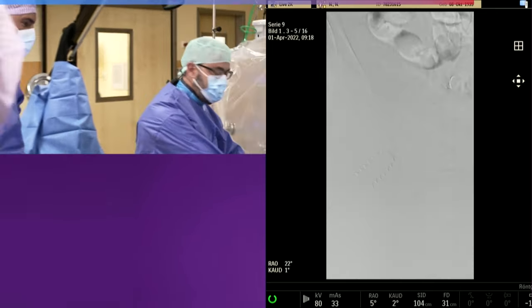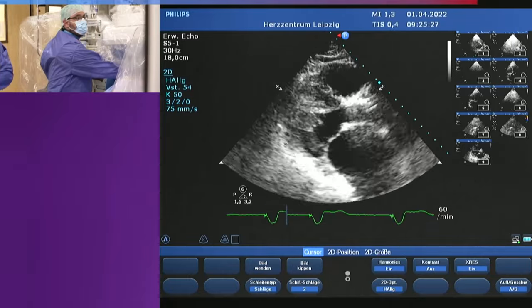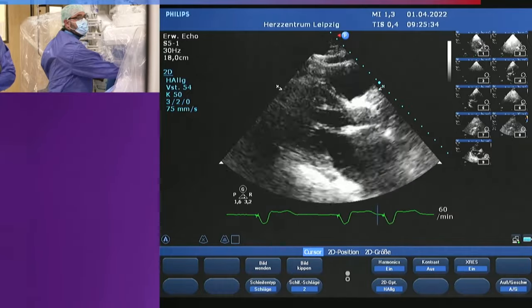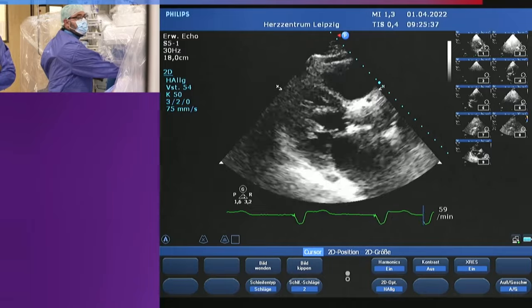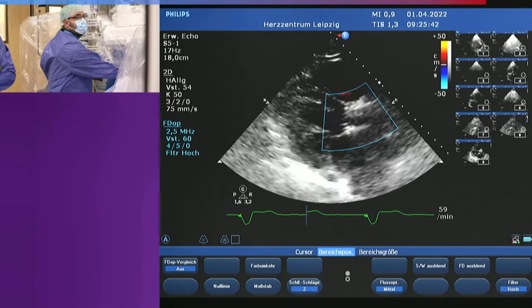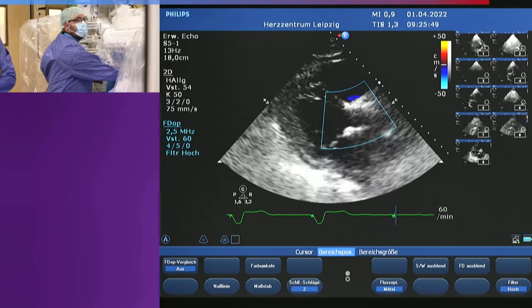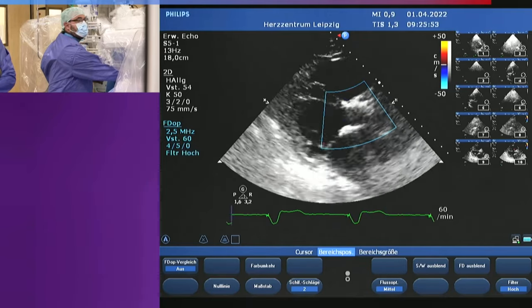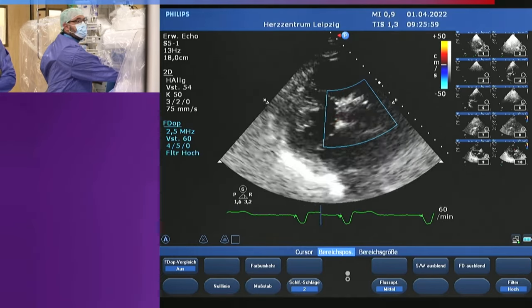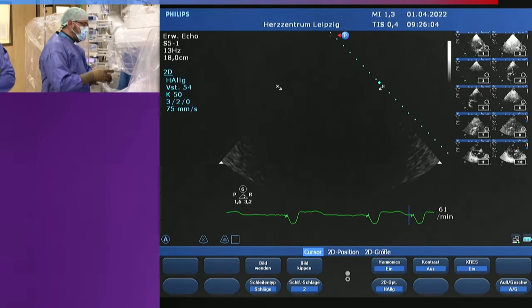Okay. So we're now looking with transthoracic echo, as you can see here. We don't have a pericardial effusion. We checked this also in the subcostal view. You see here the position of the old CoreValve. The Sapien is inside. So now let's do some color, please. And let's check if the paravalvular leak is still there. Doesn't look to be leaking, at least here on transthoracic echo. Remember, this was a rather big jet, as you've seen in the case presentation, and it appears to have disappeared now. So this is very encouraging. Again, it's a byproduct of what we did. It was not our aim, but it's good that we achieved this.